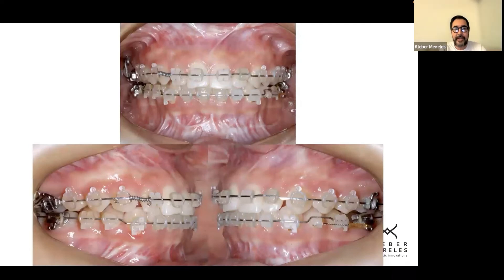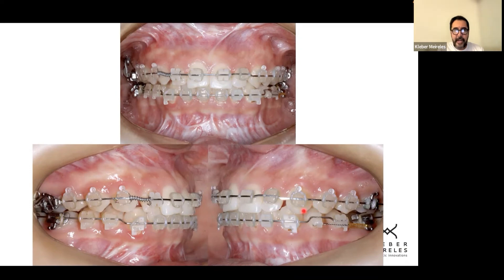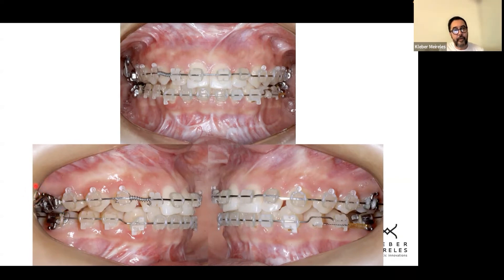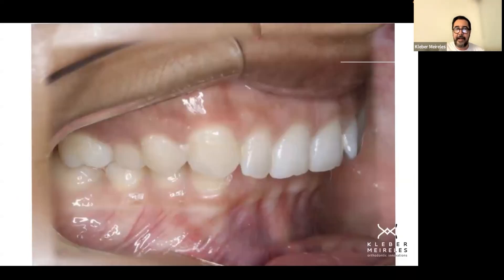After surgery, this is the case as I saw it today — the final step of refinement. We have a Class 1 on the right side, and a very good Class 1 on the left side. The patient wears Class 2 elastics on one side and triangular Class 1 elastics on the other side. And now we're closing the space of the upper right second missing molar, using the third molar being mesialized for that, and I use a loop for that.